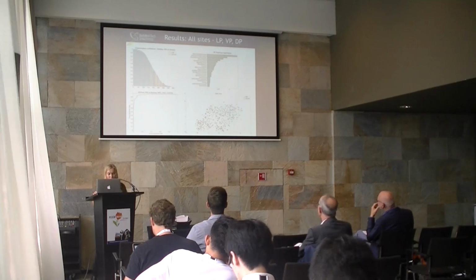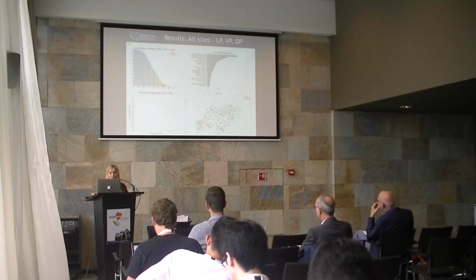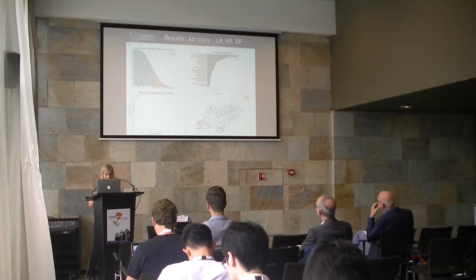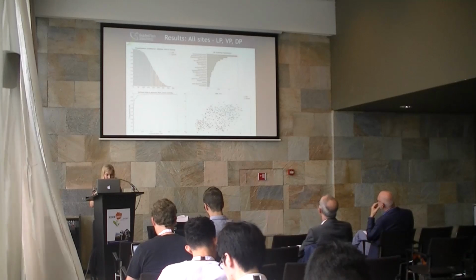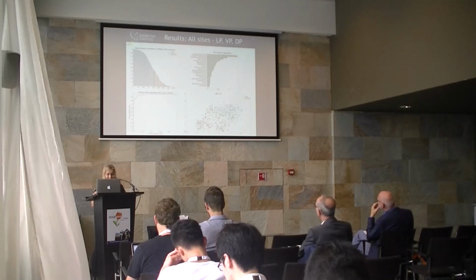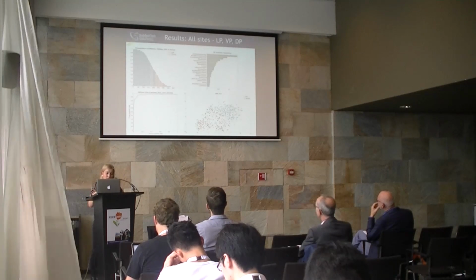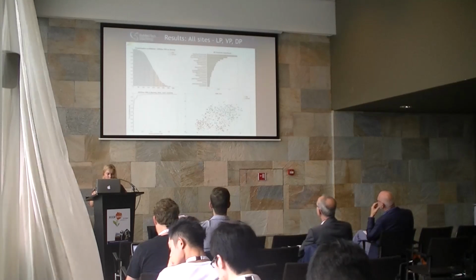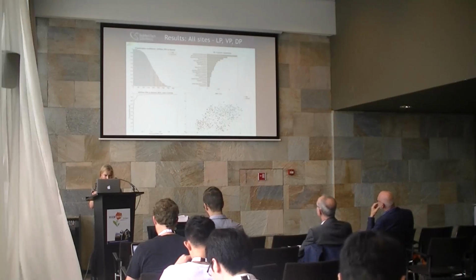Also, our model gives this information about which features were most significant in the classification. You can see there, for example, those distance features and directional features. We also calculated this receiver operating characteristic curve, which illustrates the performance of our classifier. And area under the curve was also calculated and got quite good results, 0.97.